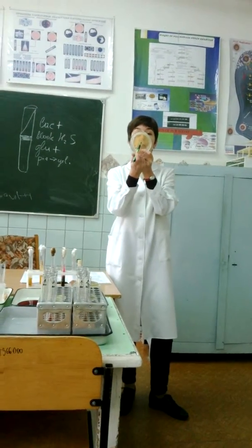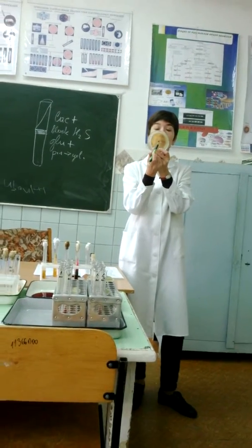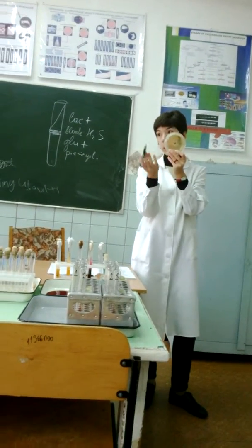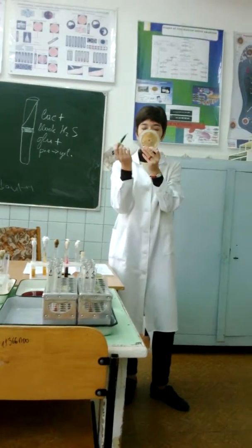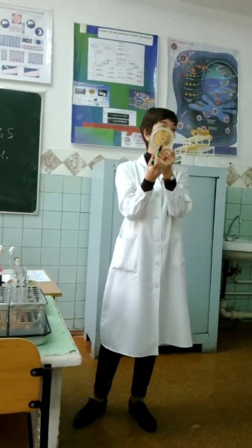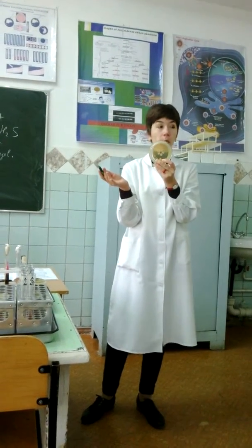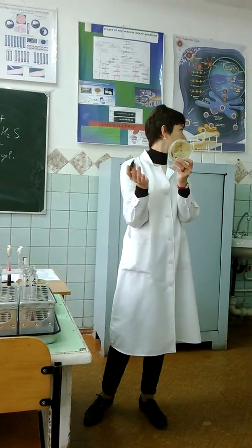Then, how to set up this test? Put in the middle a disk with antibody, in which is present antitoxic serum. Surround it with bacteria cultures of Corynebacterium diphtheriae. Cultivation one day. After one day, we check results.